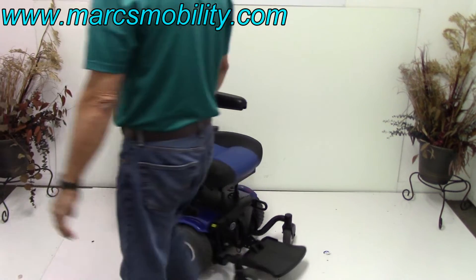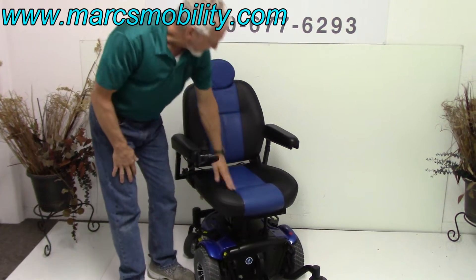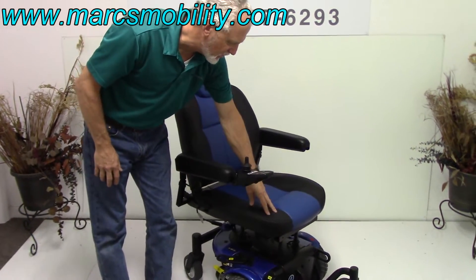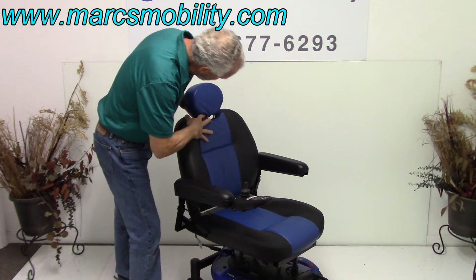Now, about the seat — you can see it's upholstered black and blue to match the chair. Very nice seat. This is the deluxe jazzy seat, one of the best seats ever made. It is a captain seat, a high-back seat with an adjustable headrest.